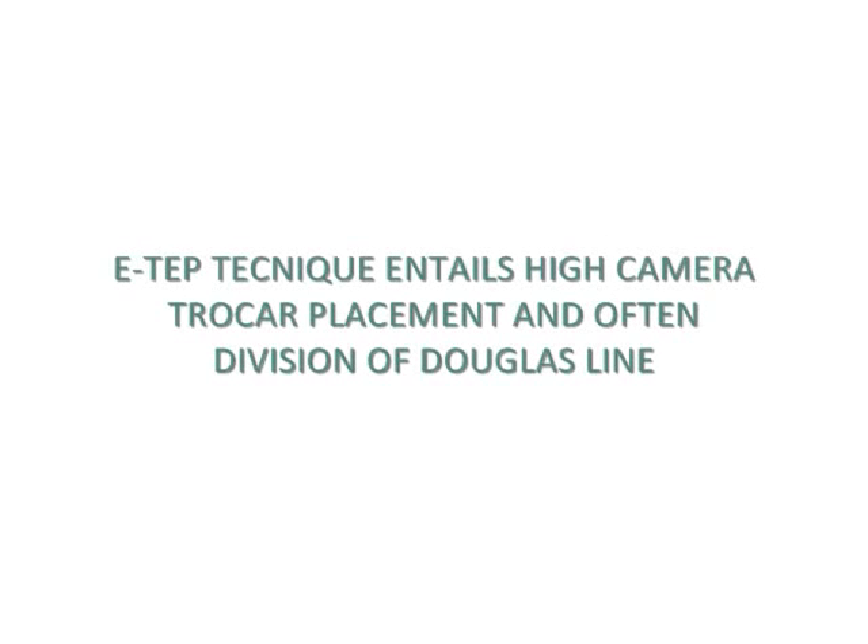Extended view totally extra-peritoneal technique entails high camera trocar placement and often the division of Douglas' line. In this video, an incarcerated hernia is repaired by this technique.